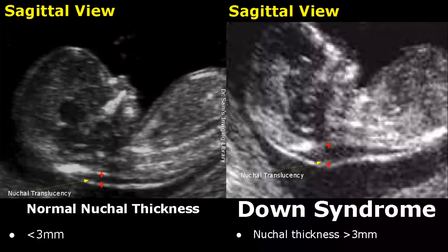Hello everyone, this is Dr. Sam. In this video we will see ultrasound soft markers for Down syndrome. Soft markers are features that may indicate aneuploidies in a fetus. We will compare these soft markers with a normal fetus.